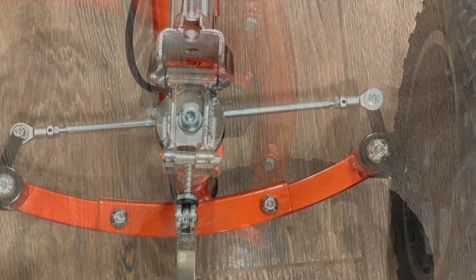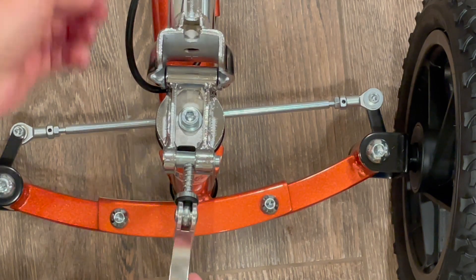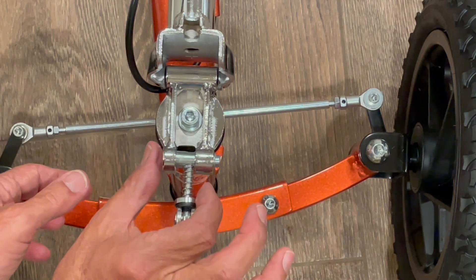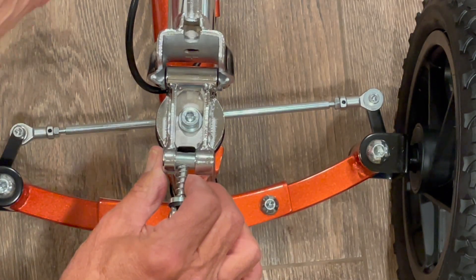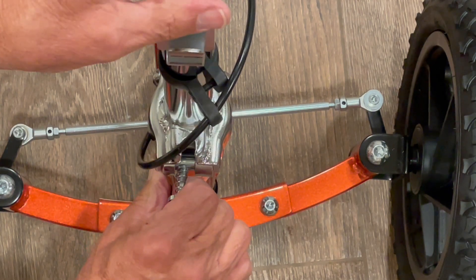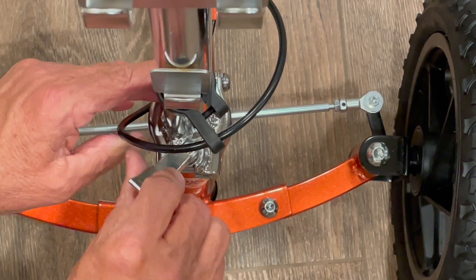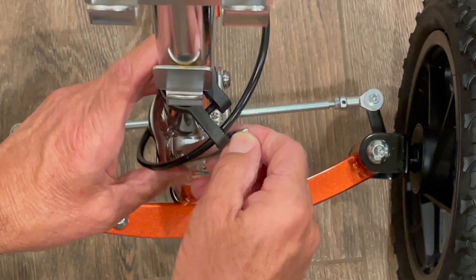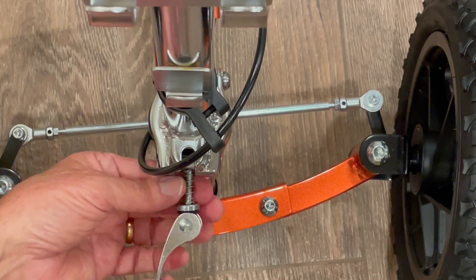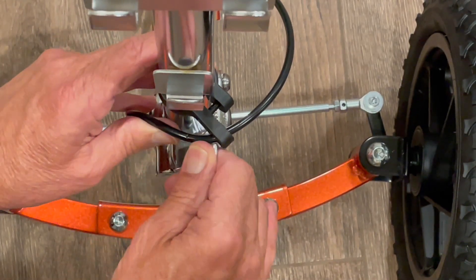We're looking down from where the handlebars are, and we can see there's a quick release here. There's a little button you can push, or put a thumb there and push to the left, and that allows you to drop the handlebars down. After you release that nut, it kind of locks it in place, and then when you lift the quick release you can tighten it down. This came too loose, so I'm going to lift it up again, turn it clockwise a little bit, and push it down because I like it to be really snug for safety.